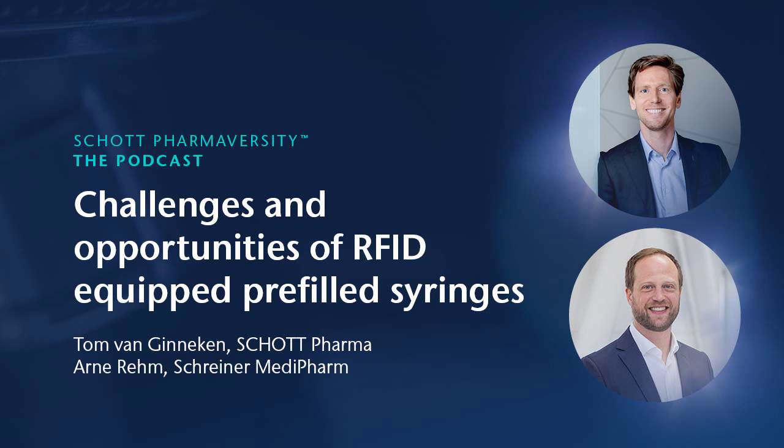Other concepts work with an online approach. So you just have an identifier and all the relevant data to the product is stored in a cloud base. And that's also one part of the pre-testing and also beneficial in the end for our pharmaceutical customers. Our concept has been tested with both kinds of approaches, and so we are agnostic and compatible to both worlds. And I'm quite optimistic that both worlds will collide in the future.